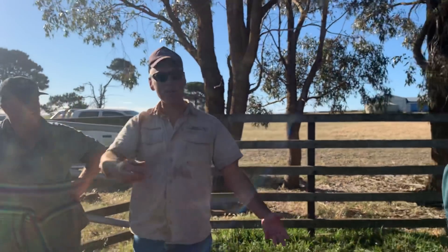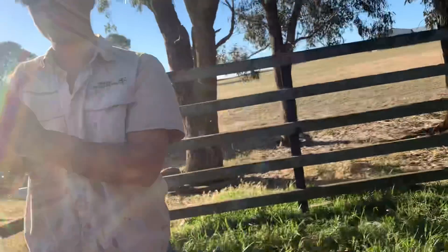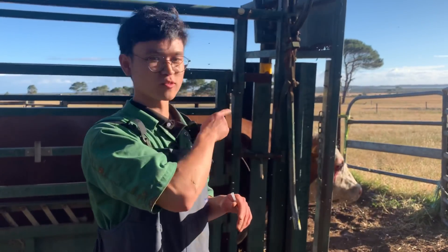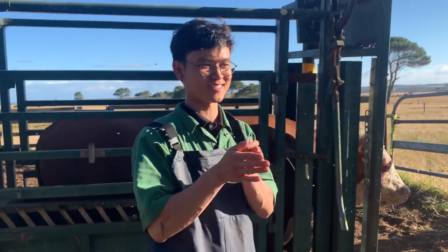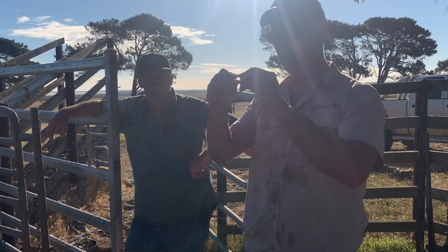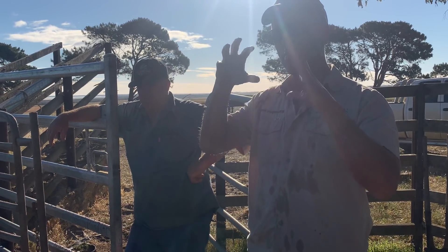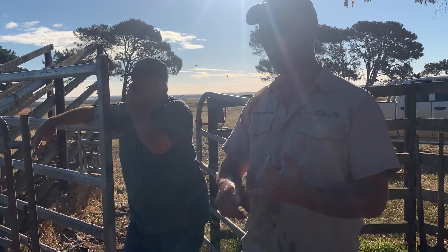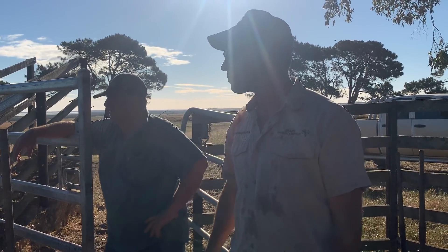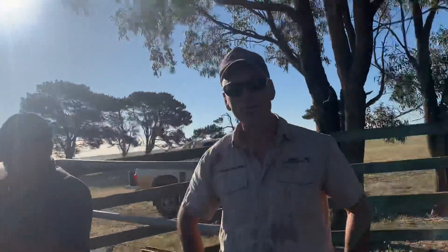You both have to have a question on camera. So Chloe, what question do you have? So how do you decide when to do this and when to enucleate the eye — what is the cutoff? Well, that one had a kind of cauliflower-ish growth, so it had a large surface but a tiny little pedicle, so that one was straightforward, really easy one to do. If it's more invasive in the eye, if the eye looks like it's compromised — her eye looks pretty good. If it's in the third eyelid, I just take the third eyelid out, but that last one we did was really invasive behind the eye, so it's got to go. They go really quickly. Does that answer your question mostly?